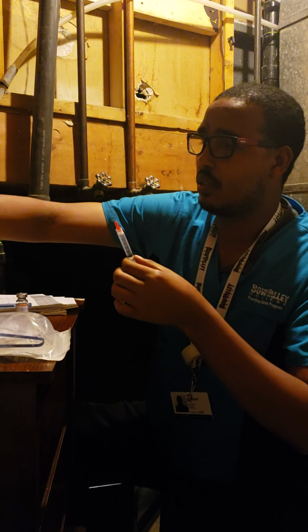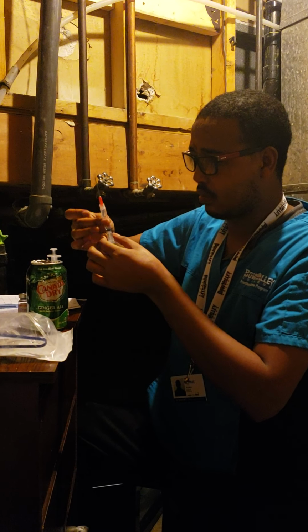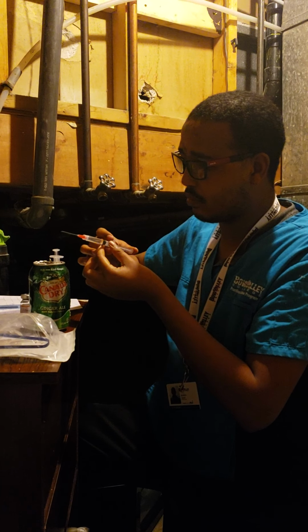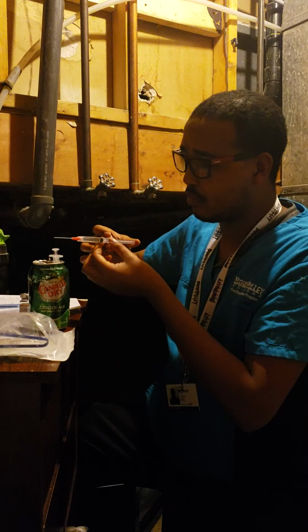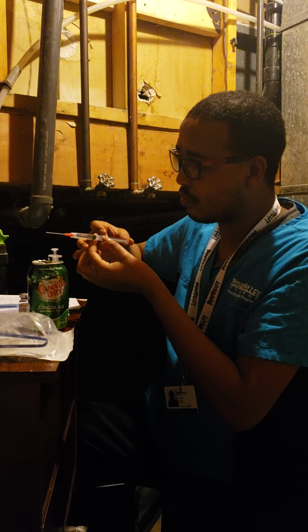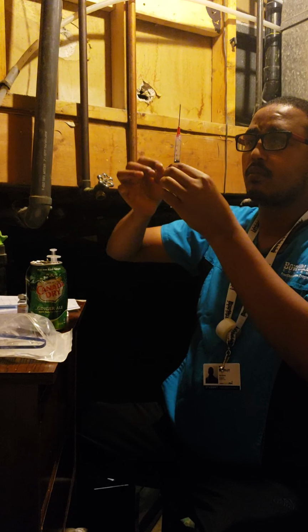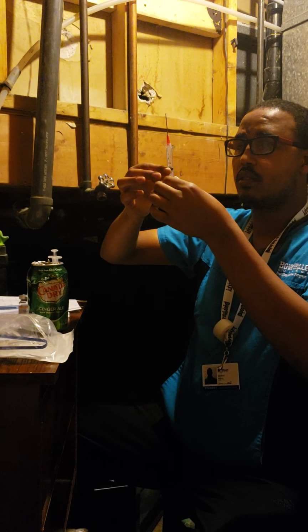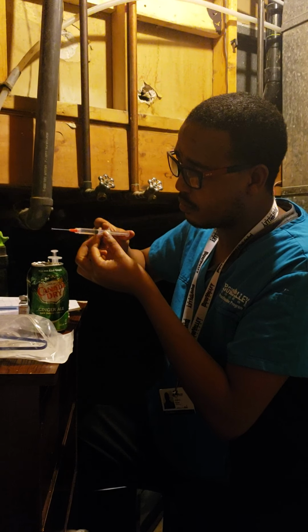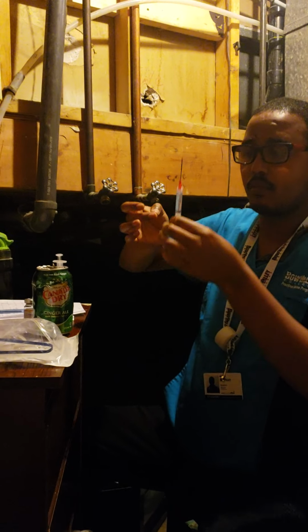No bubbles. Just a splash a little bit to get the exact amount. There is no air.